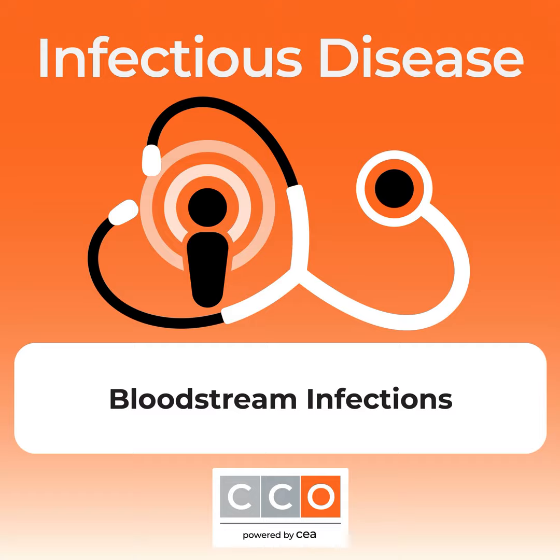And the Cobas ePlex from Roche is also a multiplex PCR system able to identify bacterial species and certain markers of resistance. All of these have identification times ranging from as little as 30 minutes to up to 3 hours when the test is run once a blood culture has turned positive.